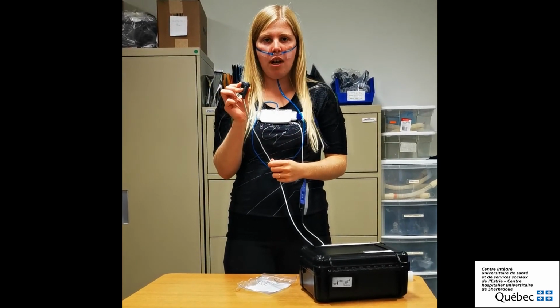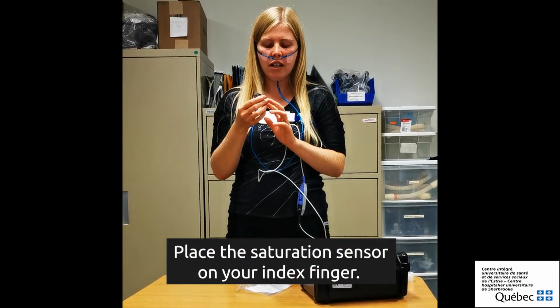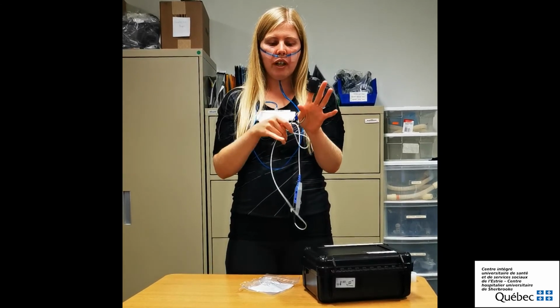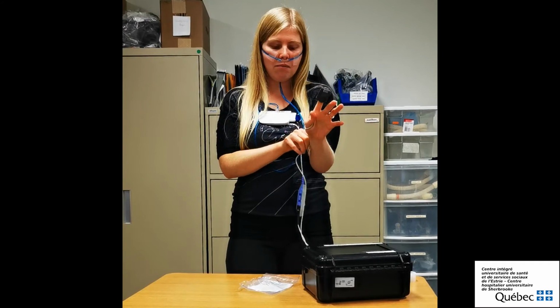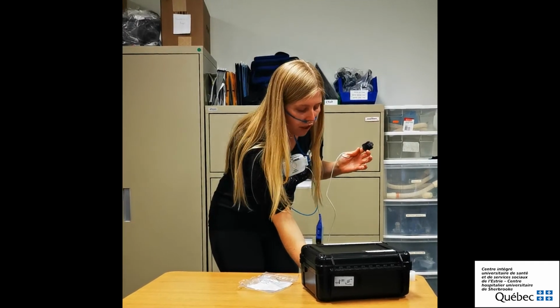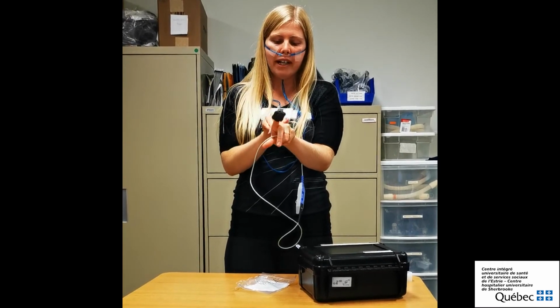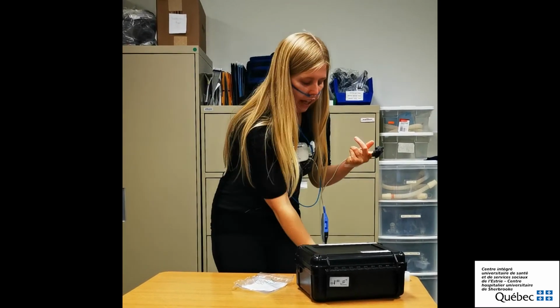Lastly, we need to install the oxygen saturation sensor on your finger. It is preferable to use your index finger on your non-dominant hand and put the wire around your thumb, putting 2 pieces of tape, one on top of the hand and the other on top of your wrist, to prevent it from moving during the night.